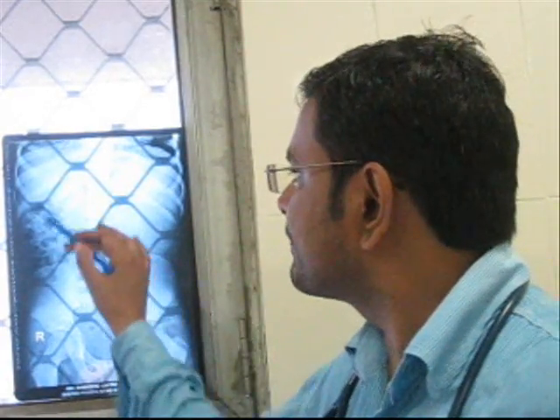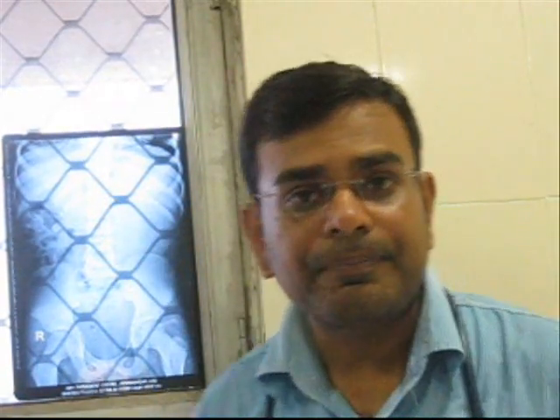KUB x-ray is used to detect kidney stones, gall stones, bowel obstruction, barium enema, position of ureteric stent, and position of nasogastric tubes. A little bit of chest is covered in the KUB so as to rule out any gas under the diaphragm.